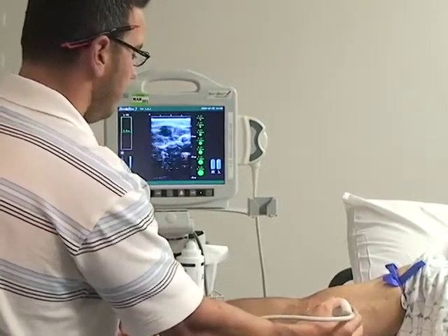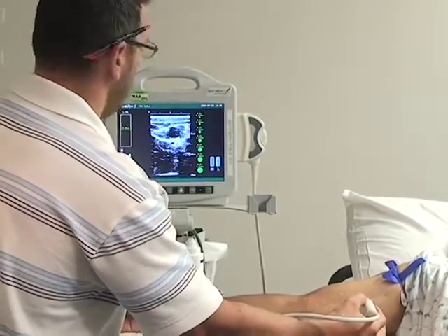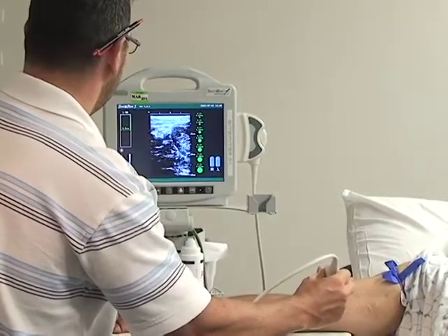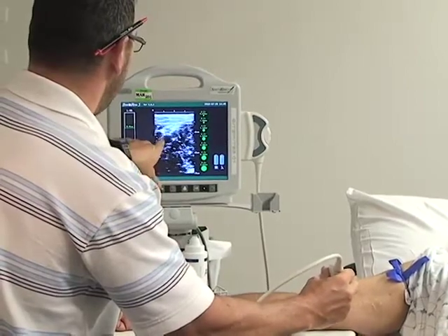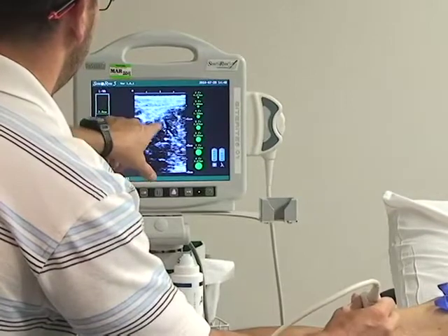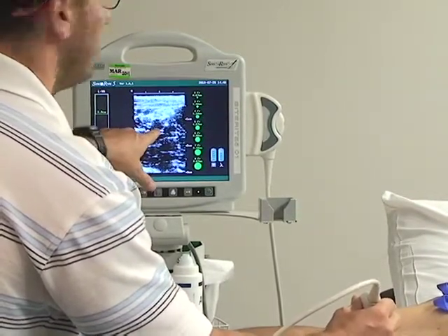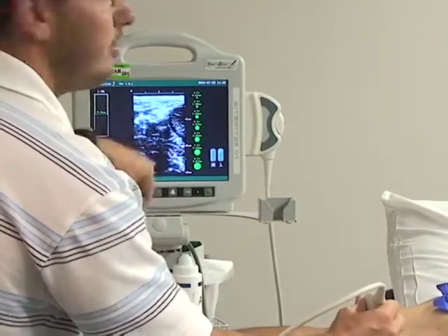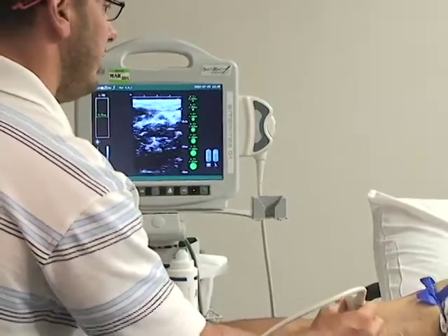When you were looking further up in the arm, it almost looked like a little Mickey Mouse head. Oh yeah, that's a good point. Thank you for bringing that up, Carl. Can you see that? Does everybody see Mickey Mouse? You actually have two ears, which are both veins, and then the one in the middle that's biggest is the actual artery, the brachial artery. That's right, it does look like Mickey Mouse.